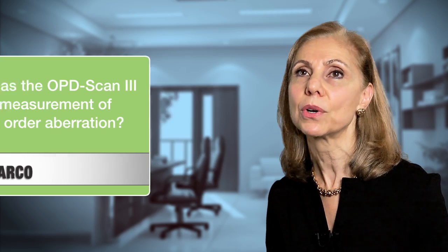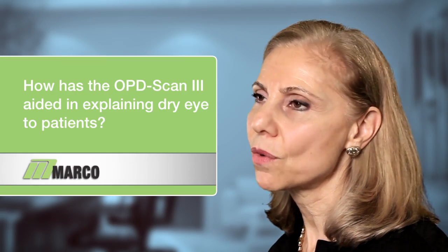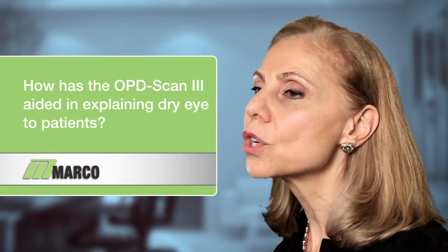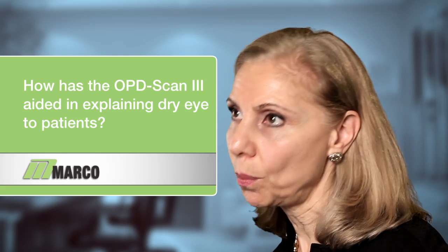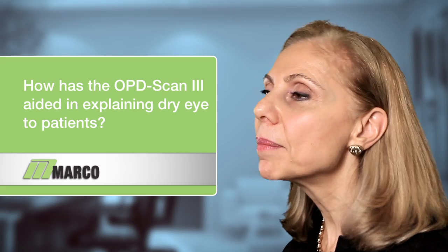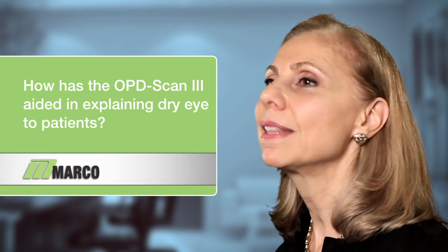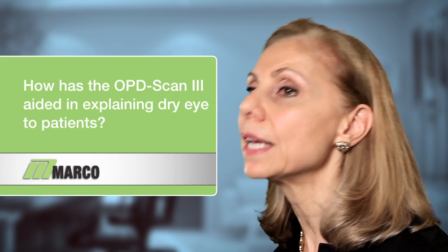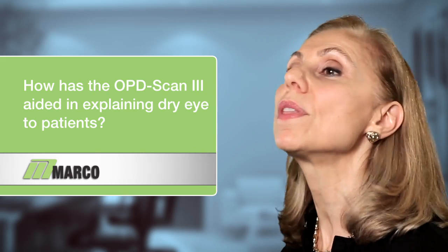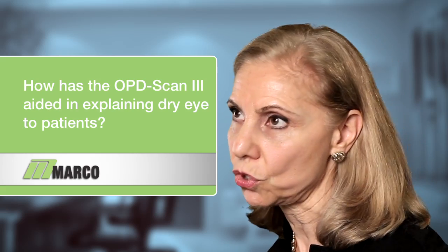At the time of the cataract visit, with each of my patients, I go over multiple maps of the OPD-3. I'm a believer if you don't discuss something with a patient beforehand, the patient will think either that cataract surgery caused it, or I gave it to them, or they will blame the entire process of the surgery or blame the surgeon.